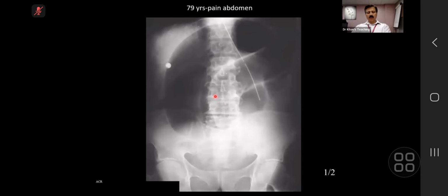But this concept is, there is a sign in radiology we call inferior convergence. And I want you to remember it. If you stretch your imagination, this is the outer line, line 1. Number 2 is the line of opposing walls. And there is the third line, which is the line of this loop, which is descending down. Inferior convergence is that these 3 lines will converge to a point to the left side of the pelvis. This sign is known as inferior convergence.